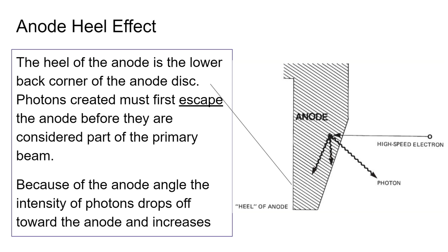So being that that photon's going that direction, that's why I'm saying it's getting higher towards cathode. So, right, if you multiply this, that means you're going to have a whole bunch more intensity, more photons on the right side towards the cathode, and less on the other. So that divergence that we've always talked about is not perfect. It's like two shower heads going this way, but one's stronger than the other, right? When I say stronger, actually more water comes out of one than the other.